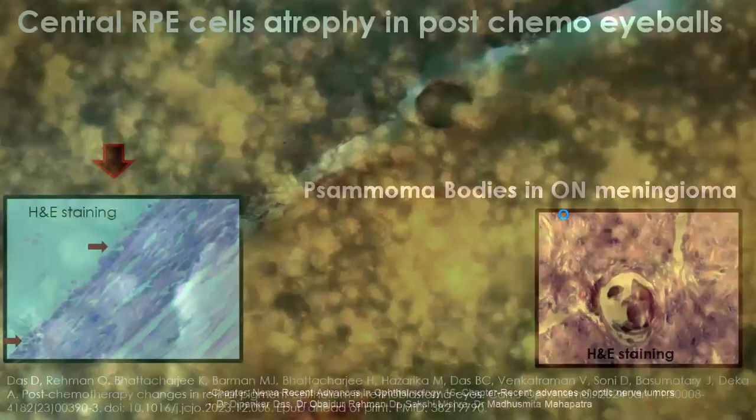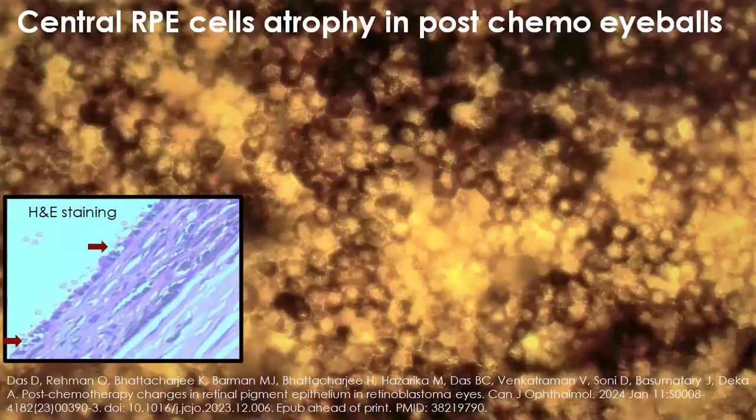Now this is very, very important. Four or five years back, I was observing post-chemo eyes with retinoblastoma with typical central clearing. The area where the nucleus is should be filled, but it is empty all the way. Trillions of doses of chemotherapy have been given for various cancer indications, but in raw specimens in end-on view we started to see this, and there is no earlier evidence elsewhere.